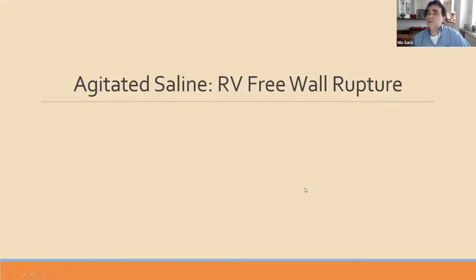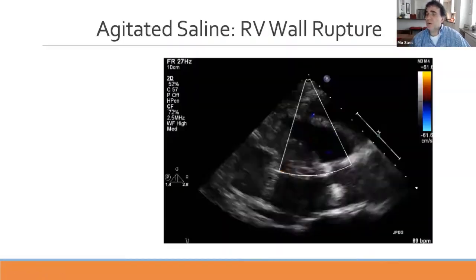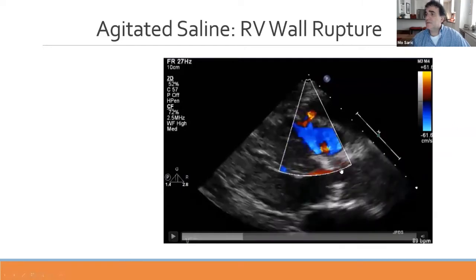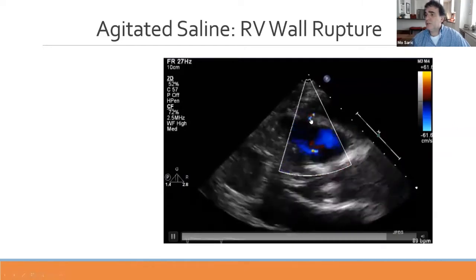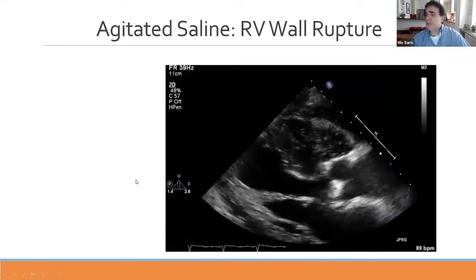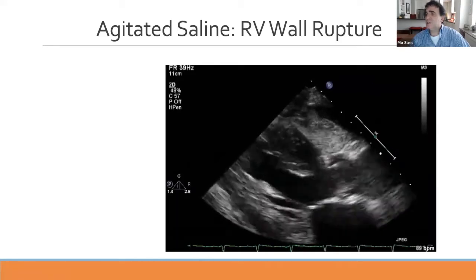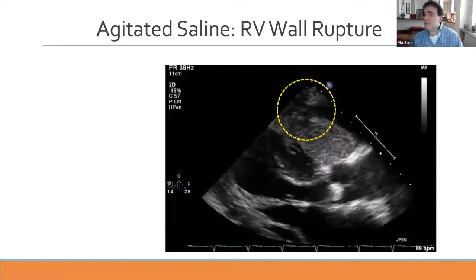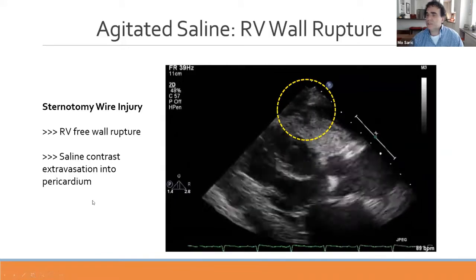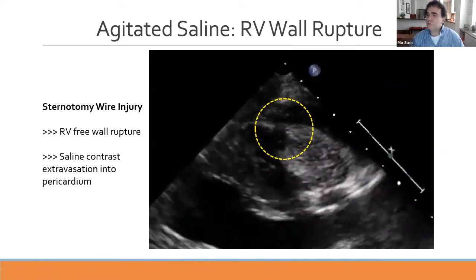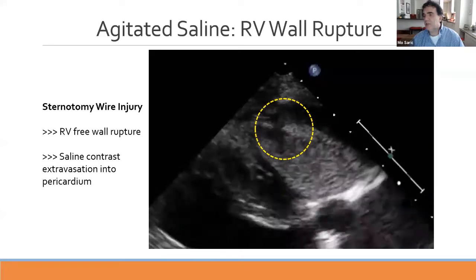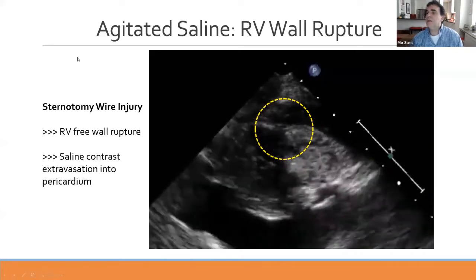There are other uses for agitated saline, such as detecting right ventricular free wall rupture. In this patient after bypass surgery, there is a perforation of the right ventricular free wall. With agitated saline injection, you can see true extravasation of fluid into the pericardial space through the free wall rupture—demonstrating the utility of agitated saline for right-sided lesions such as a perforated right ventricular free wall.